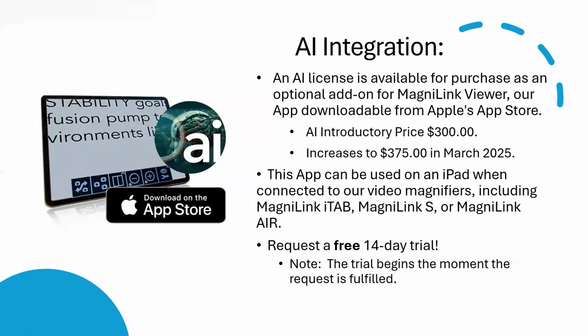Some questions that have come up for us since we've introduced the AI integration are about pricing: how does the license work? Is it different than the text to speech licenses? And the answer to all of that is yes, it is different. And we're here today to clarify any questions that you might have about that.